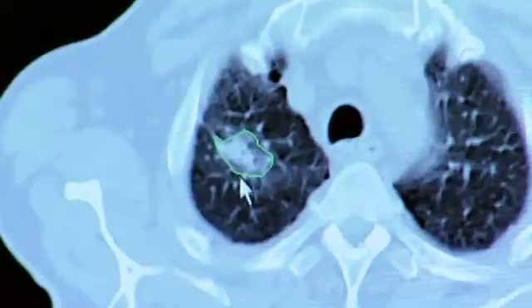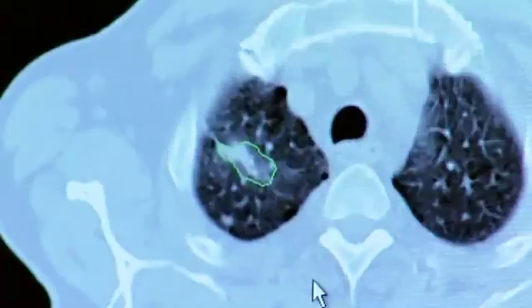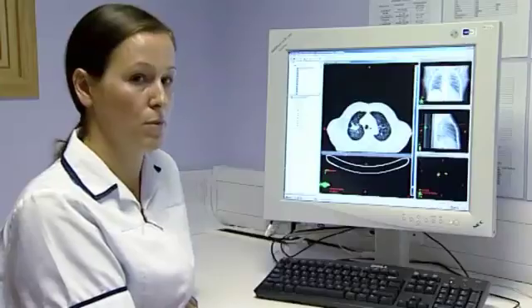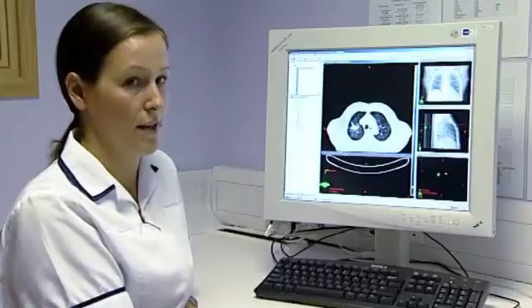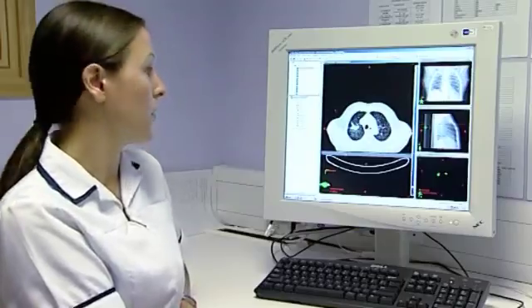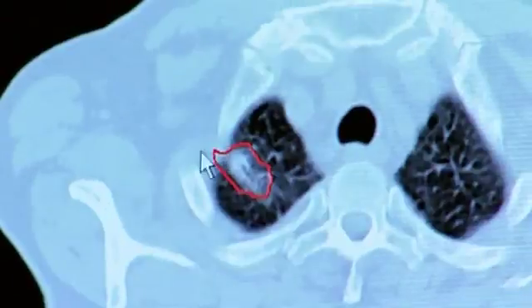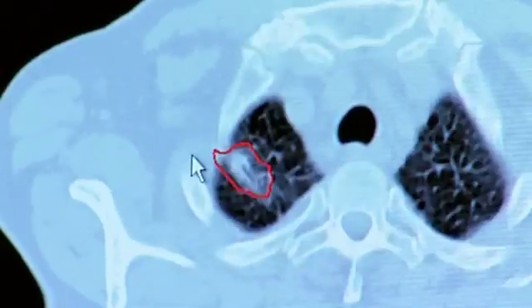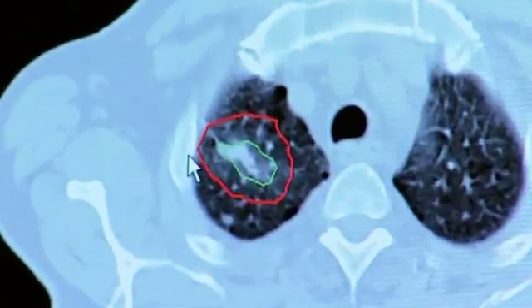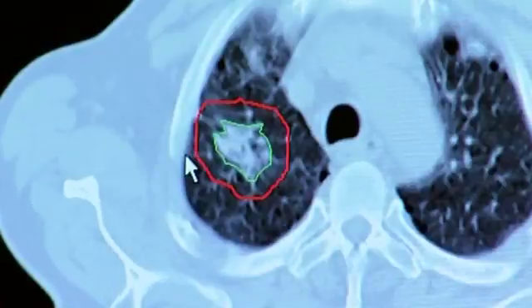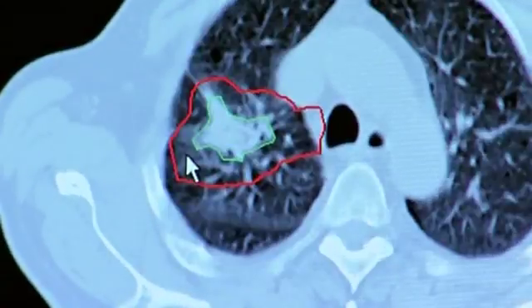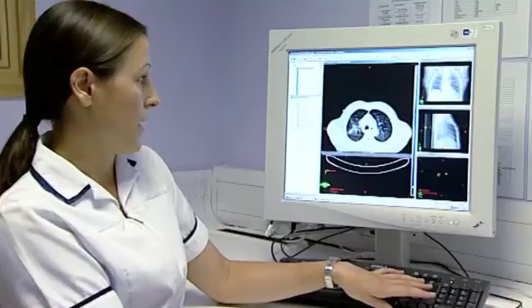From here, the doctor then needs to apply a margin of subclinical tissue to produce the CTV, the clinical target volume. This is the volume marked in red. Margins are applied to the GTV in the superior, inferior, anterior, posterior, left and right planes.